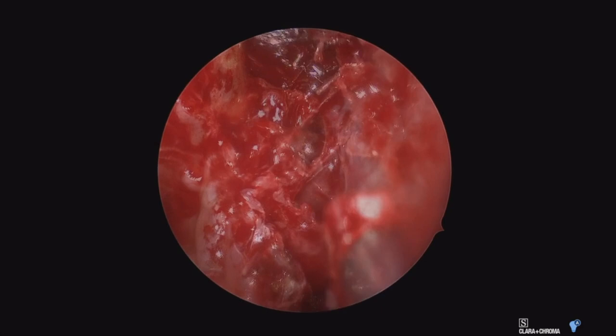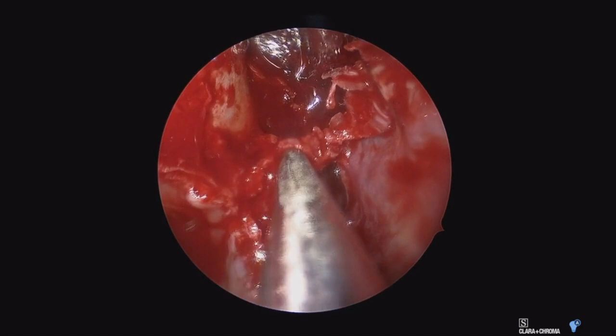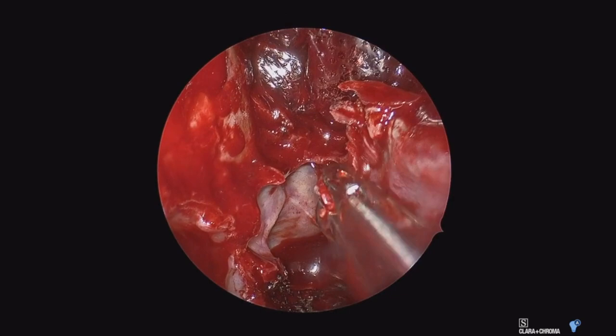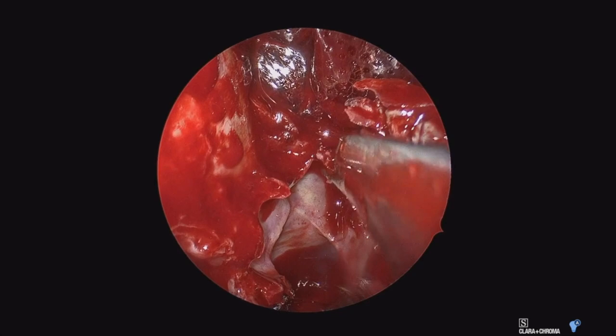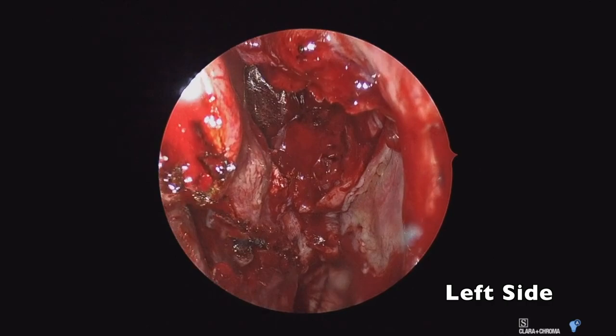Here we are now opening up the sphenoid sinus. I like an up-biting Kerrison for a lot of the work back here towards the sphenoid. The sphenoid mucosa looks very normal. We will sample the areas around here to ensure it's negative as well, but it certainly has a normal clinical appearance.